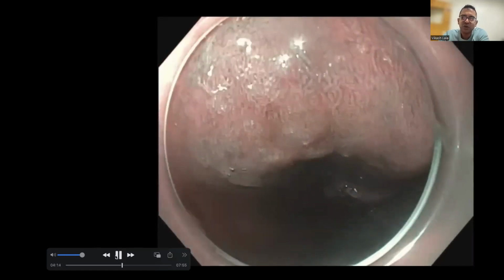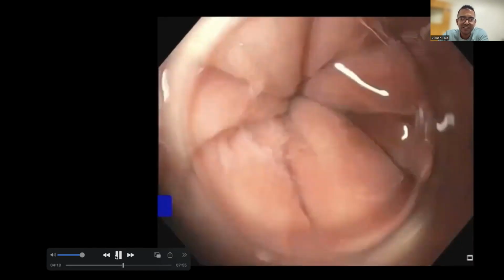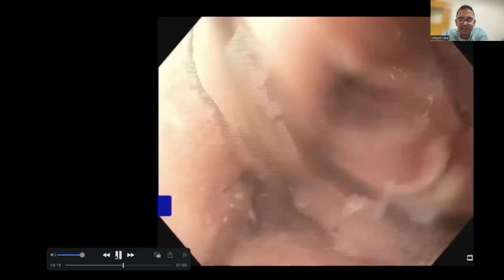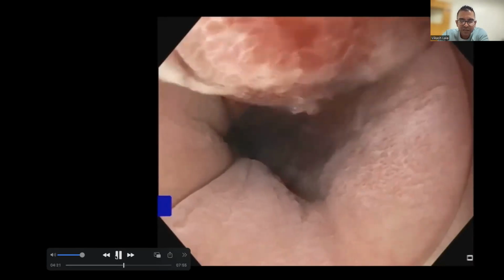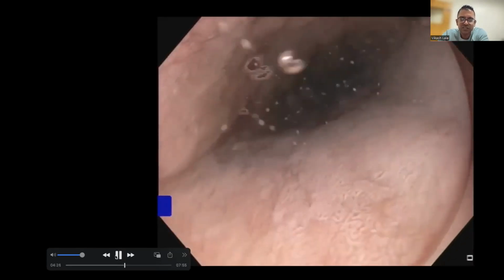So now you're going to have squamous growing over your dysplastic adeno area. And that's a recipe for disaster. That's Barrett's, and that's a big issue. So here I'm applying acetic acid. Again, the patient was intubated, so I wasn't too stressed about aspiration.